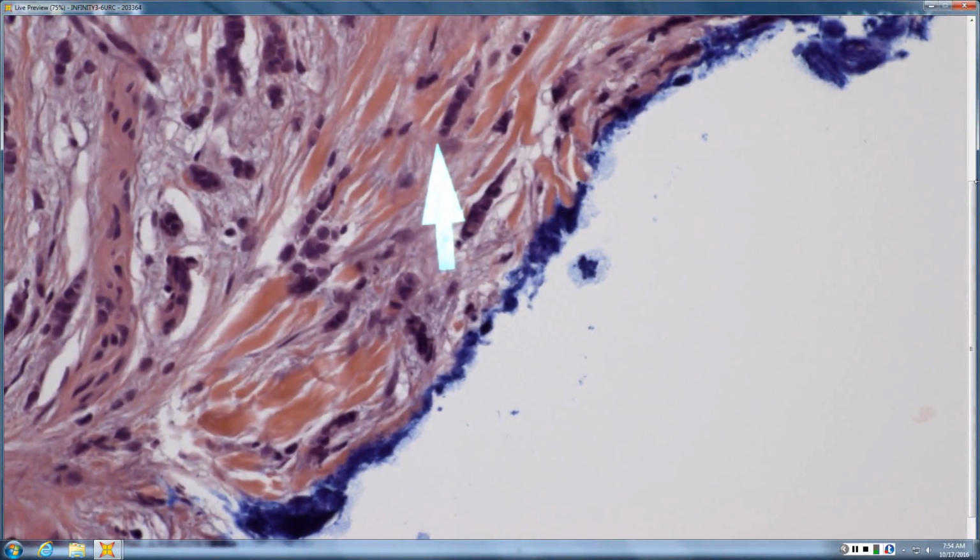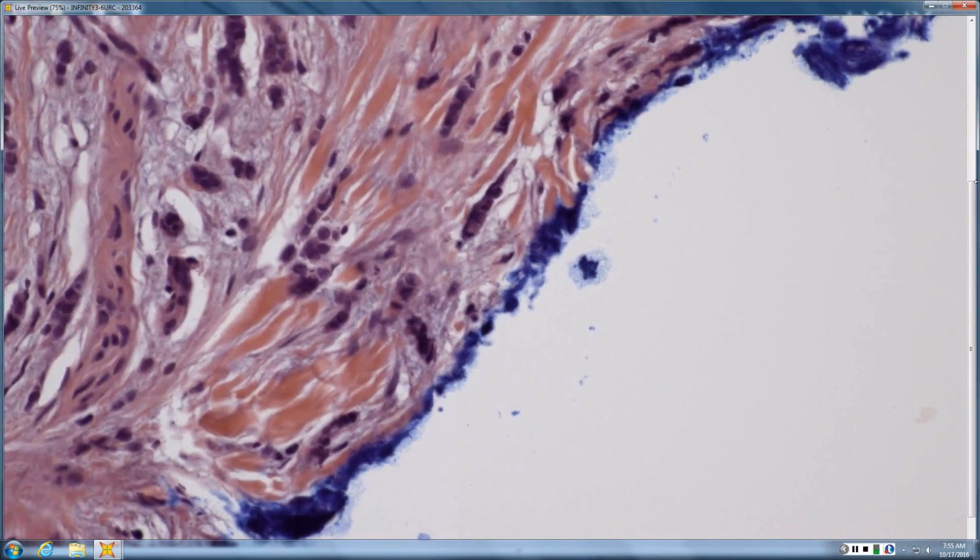So busy dermis, interstitial GA-like pattern. Look closer at the cells. If hyperchromatic, in boxcar fashion with nuclear molding, that is metastatic breast.